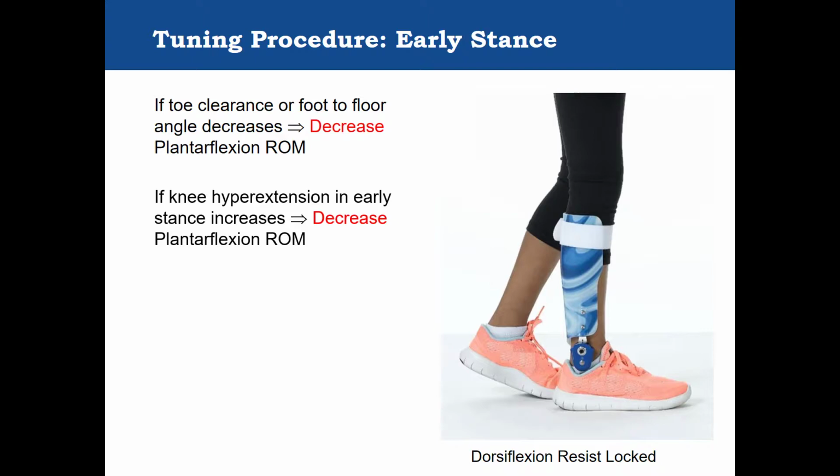If the plantar flexion range of motion must be set to less than 5 degrees to actively manage the position of the ankle or the stability of the knee, it may be necessary to increase the resistance of the plantar flexion spring by changing the spring configuration. However, the passive range of motion of the ankle in dorsiflexion as relates to ankle alignment should also be considered.